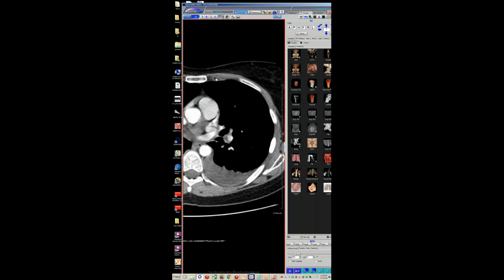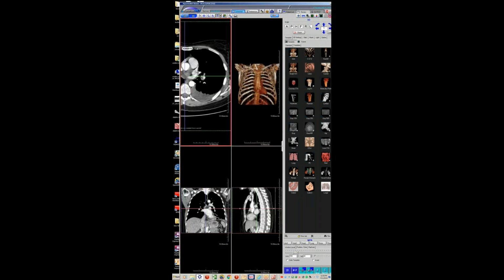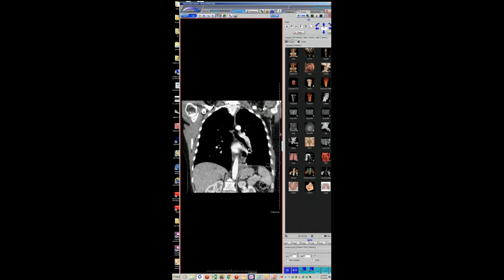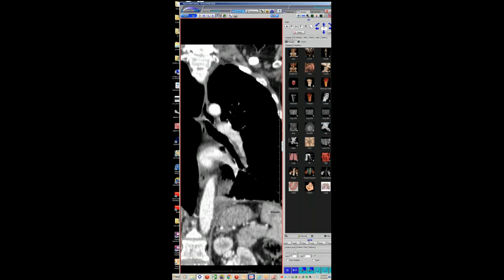I think you were not on a couple weeks ago. I showed an aortic sarcoma, similar to these. What's your distinction between an angiosarcoma and an intimal sarcoma? Because in this one, it was like an angiosarcoma, which my understanding is just that they're more aggressive than intimal sarcomas, or do you know if there's... I have not seen many. Most of the sarcomas I see are purely intimal sarcomas. I don't know if I've seen an angiosarcoma. Of all the pulmonary artery cases we have, I don't know if any were angiosarcomas.